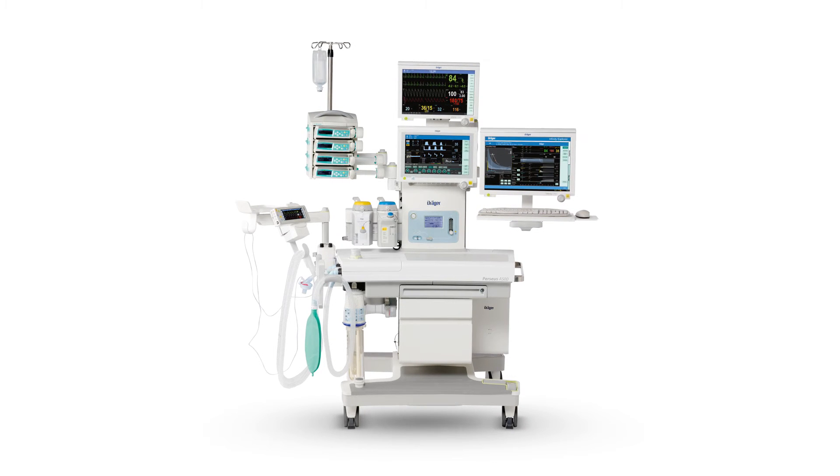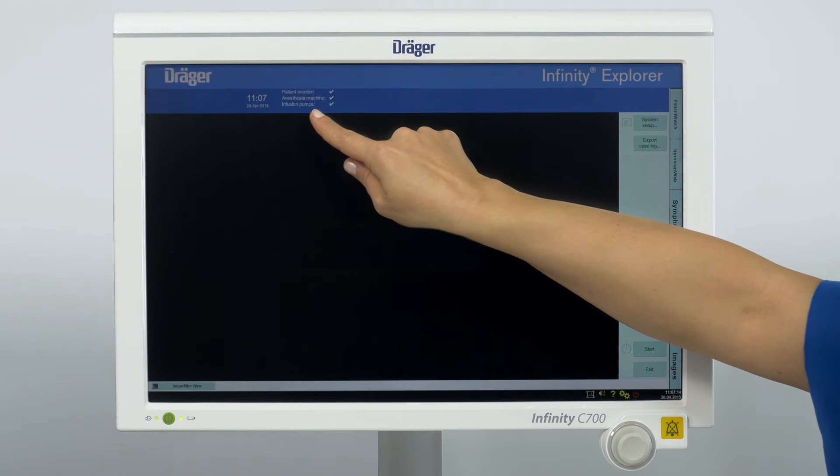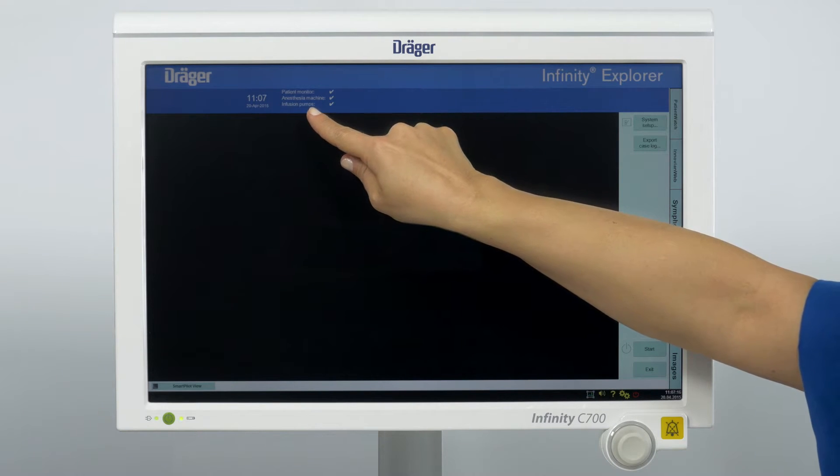Check the SmartPilotView screen in standby mode. The top blue bar displays the connected devices.